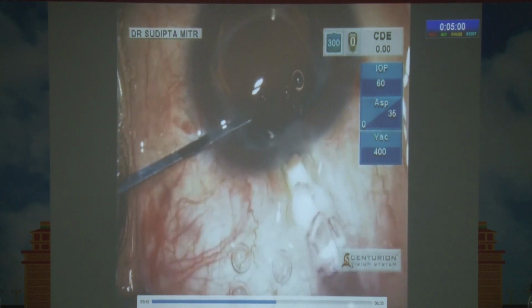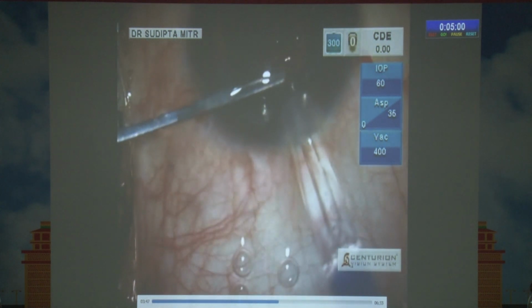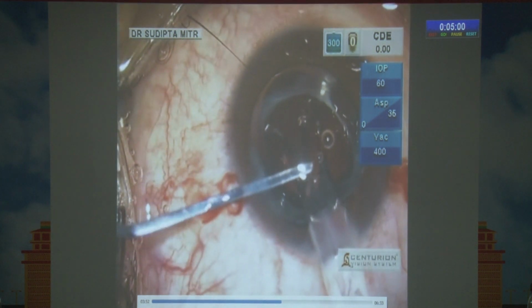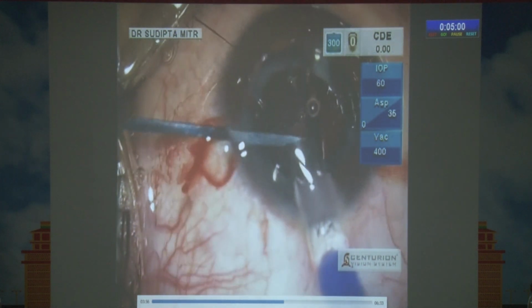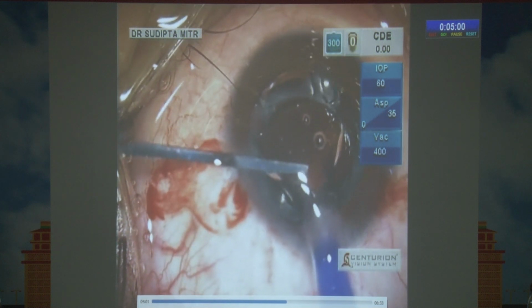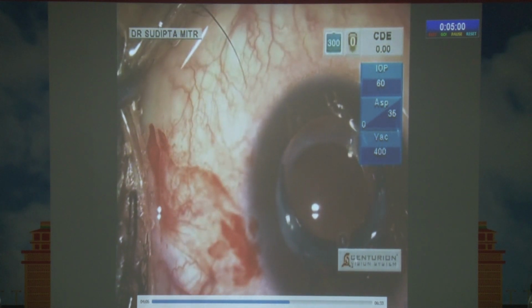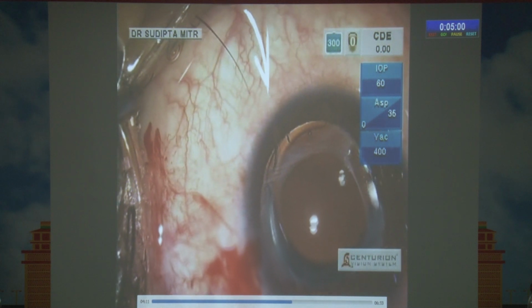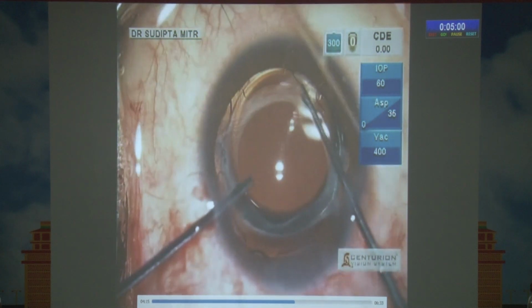With a phakic IOL, I usually use a spatula in the left hand to guide my IOL, and this was also the same. The only difference was that I did not want to deliver it inside the iris, rather I delivered it over the iris, because I had to put it in the sulcus, not in the bag. In case it went in the bag, I would be in a soup. So I delivered the leading haptic on the iris, and then the trailing haptic too. As you can see, the leading haptic has a notch which has been marked, and this is the identification that it has been placed properly.